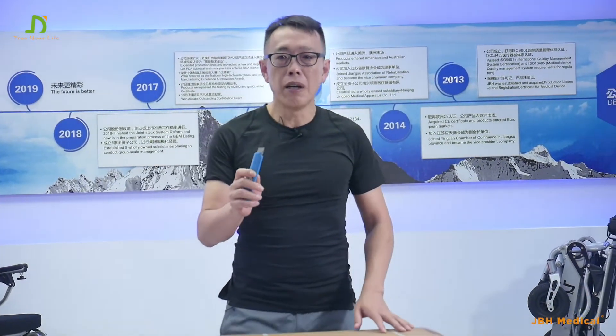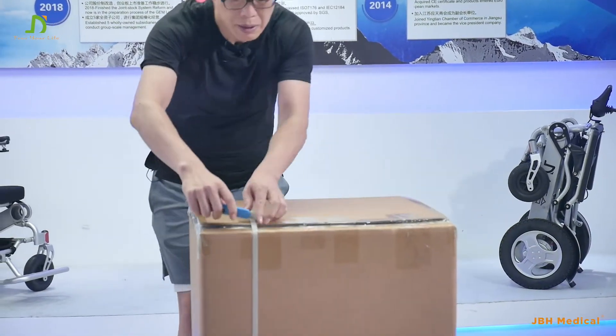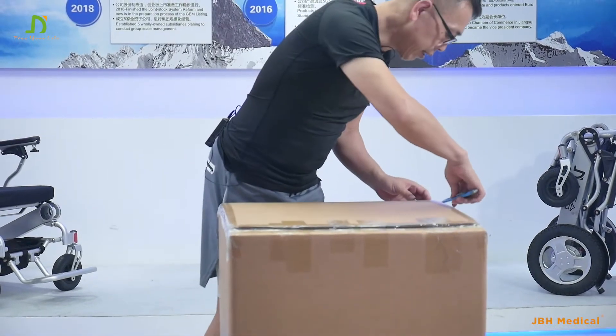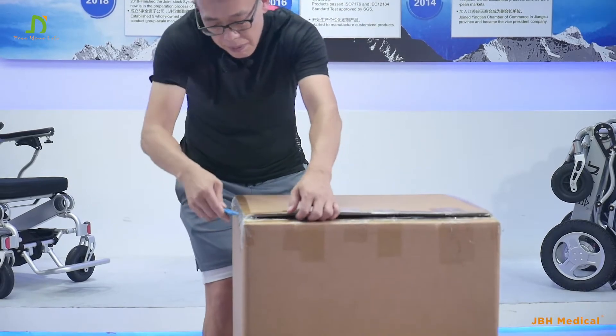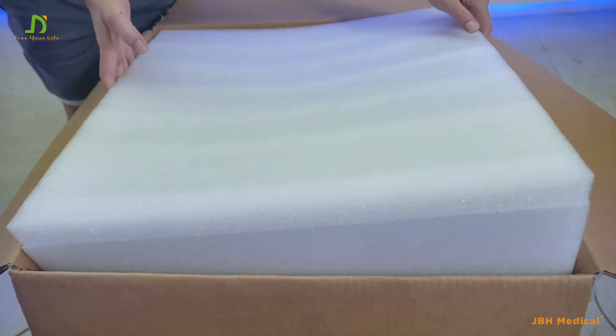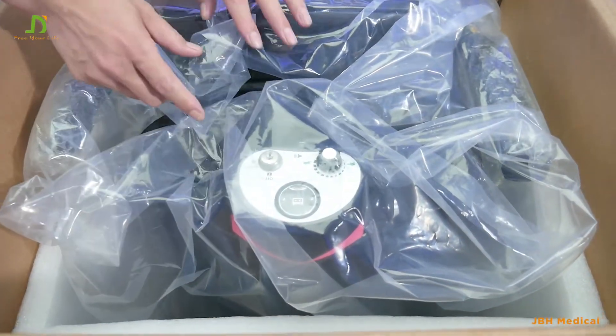First, you need an opener. Open the belt here, cut the belt here, and then here. We can take out the top of the box here, then you'll find the scooter here with plastic.